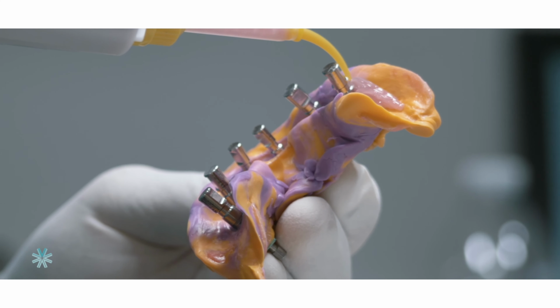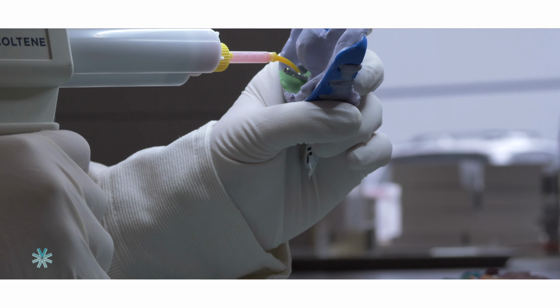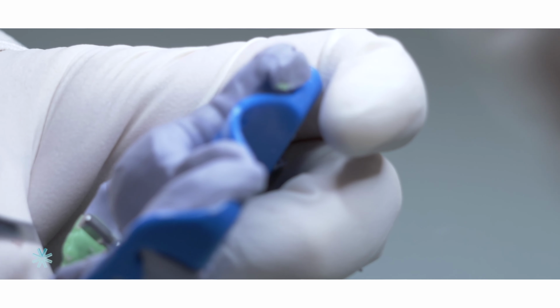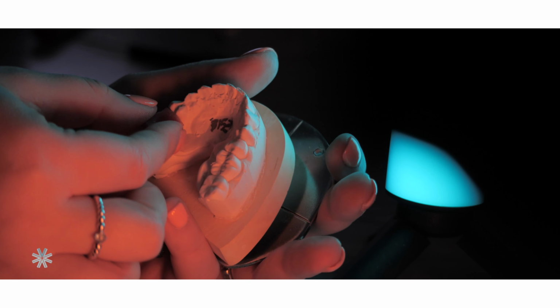If it's an open tray style, all that means is the impression coping stays locked inside of the impression. So there's a screw that sticks out from the other side of the impression. We'll then place the analog and screw it together. We'll pour a soft tissue model, meaning we use a gingival mask material just around the implant site. And what that does is it'll replicate the actual soft tissue. Once we've done the soft tissue application, it'll go off to our model department and they'll pour up the stone model. If all goes according to plan, what we've done is just created a reverse copy.